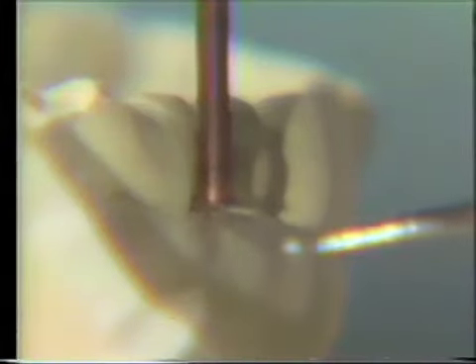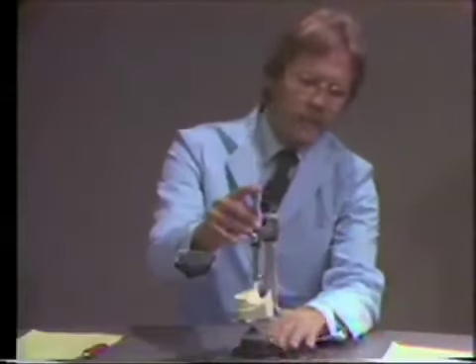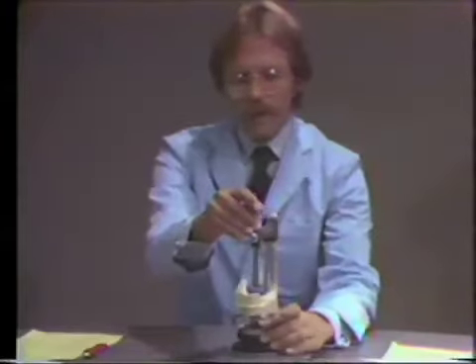and I can improve that with a gold crown by making that amount of retention up slightly higher so that the retentive part of the clasp does not lie on or near that gingiva. I would prefer, when I have control over the amount of retention, to bring it up just slightly from where it is in this particular situation, so that the clasp unit does not lie on the gingiva. So now that I have all the requirements, both hard tissue, meaning the abutment teeth, I have the requirements fulfilled.